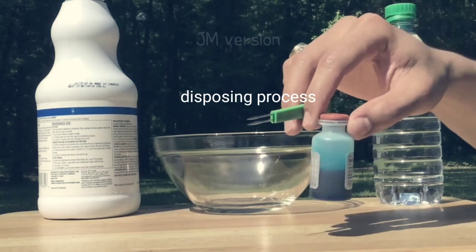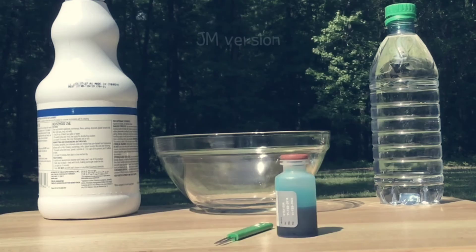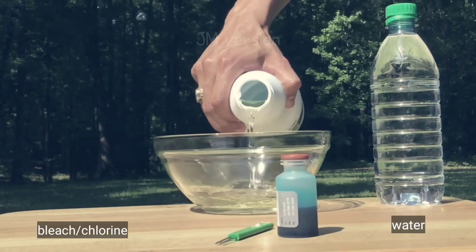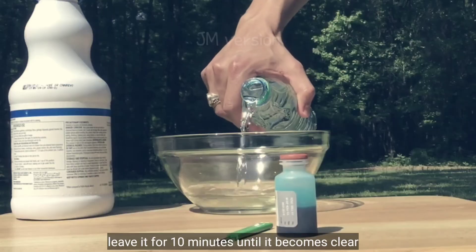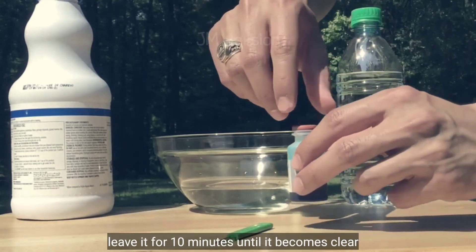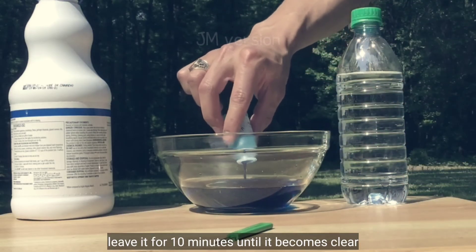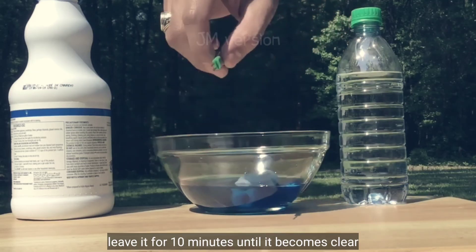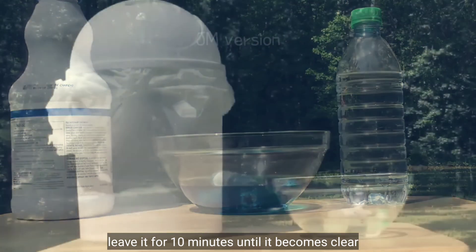To dispose of your vaccine supplies when you are all done, simply take the vaccine bottle and applicator stick and set it in a bowl that contains a 50-50 mix of bleach and water. Leave it in this mixture for 10 minutes. Once you pour the contents of the vaccine bottle into the bleach mixture, you will see it quickly fades to clear.